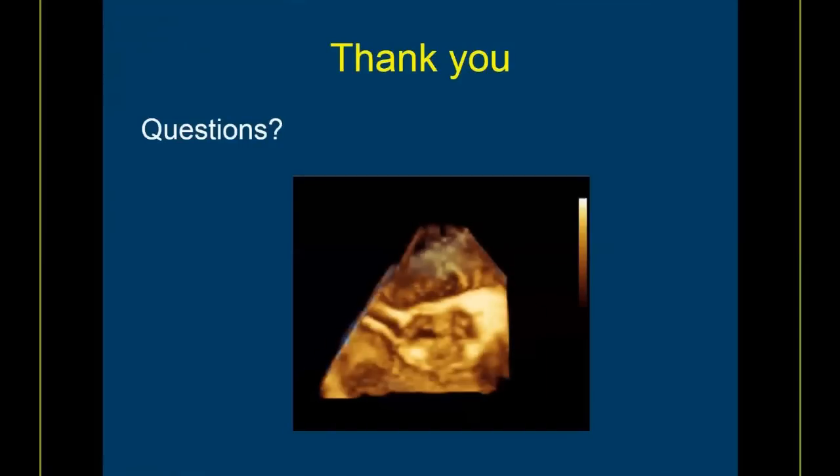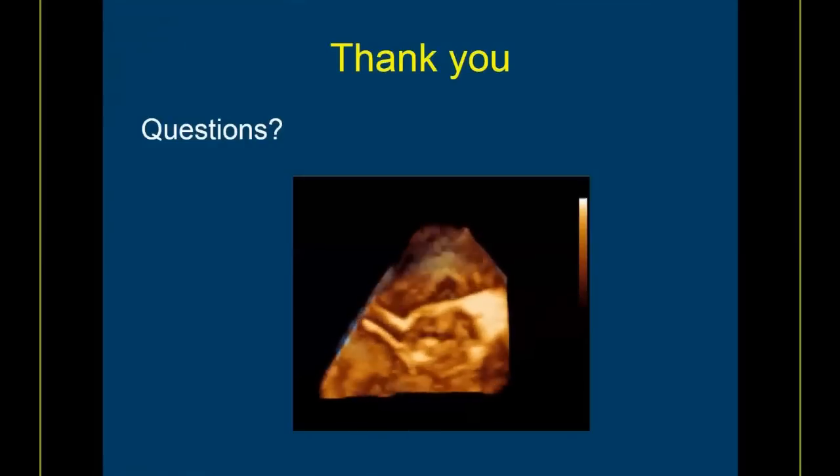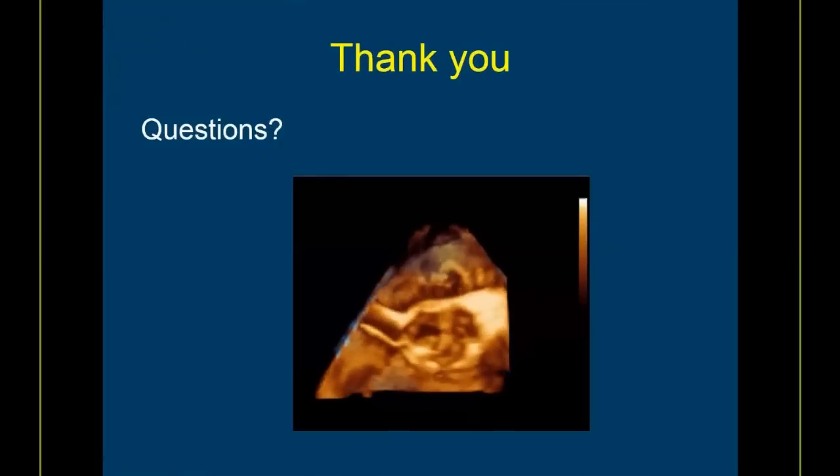Another question is, what would be the best view for aortic valve area measurement? LVOT and PLAX, planimetry, or VTI? I'm not sure I completely understand the question, but best view for AVA measurement? If you're talking about the LVOT diameter for the continuity equation, we recommend that this be done in a parasternal long axis view, please zoom that view, and it be done in mid-systole.